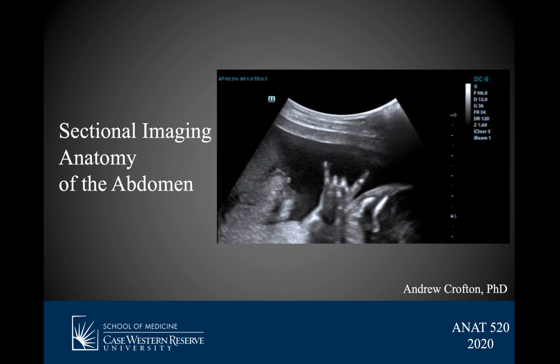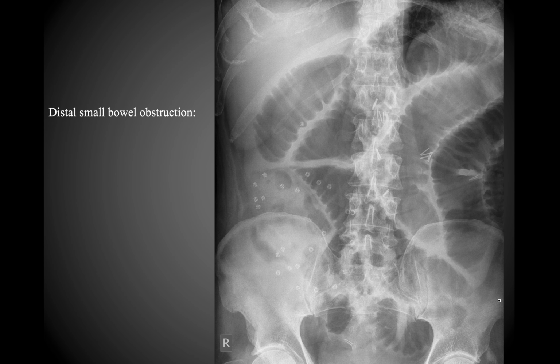This video will cover an introduction to sectional imaging anatomy of the abdomen. So we're going to start out by doing a quick review over some of the content that we talked about last week. We mentioned multiple times what a small bowel obstruction looks like.